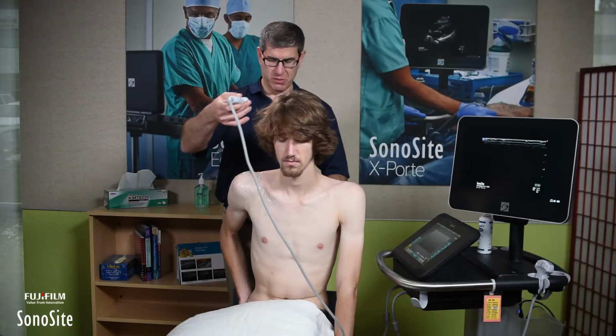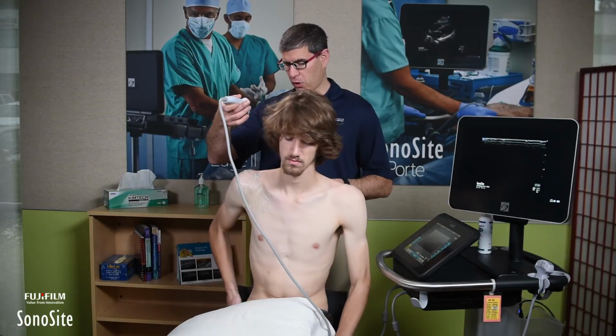Next thing I want to do is take a look at some dynamic impingement. So if you can go ahead and put that arm back into that initial home view. Let's actually get you into sort of like your baseline laptop posture.